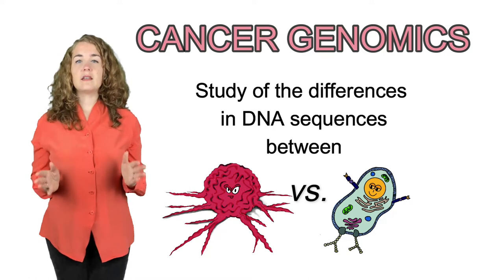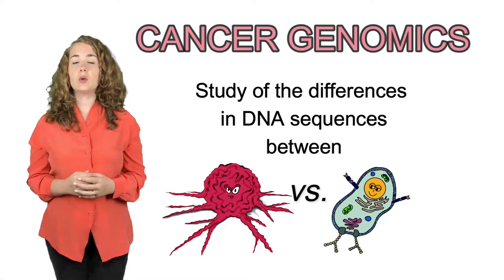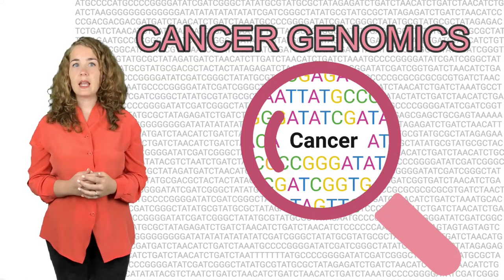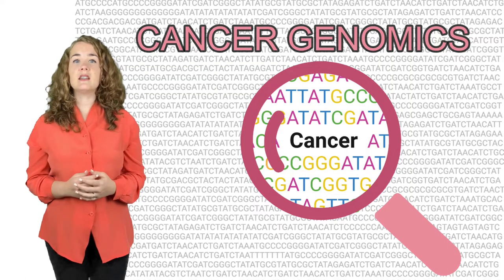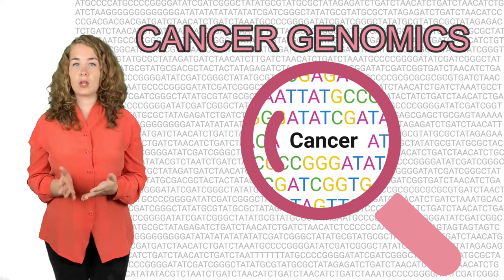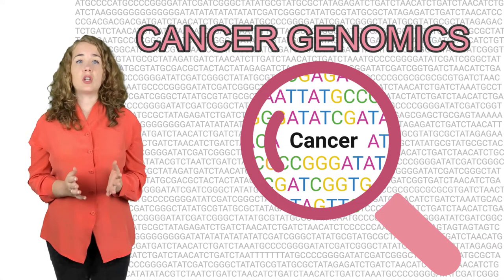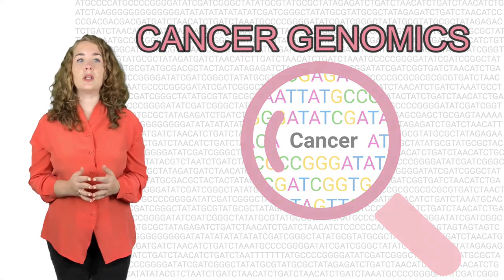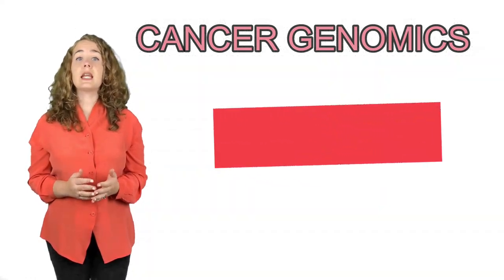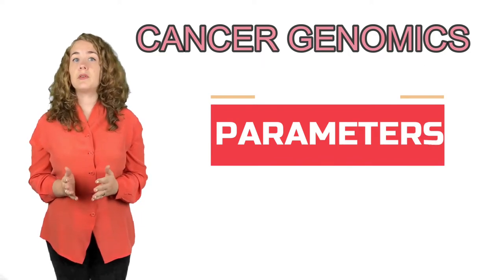Cancer genomics is the study of the differences in the DNA sequence between tumor cells and normal cells. Through genome sequencing, we can identify these genomic alterations and therefore characterize the tumors to understand their sensitivity to therapies and predict their prognosis. Cancer genomics represents a powerful tool in oncology, but there are some technical parameters we must be aware of to correctly design and perform cancer genomic sequencing.